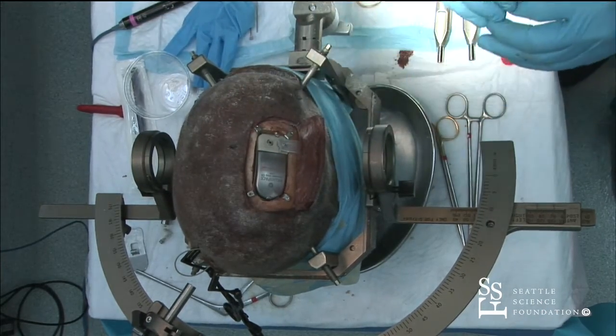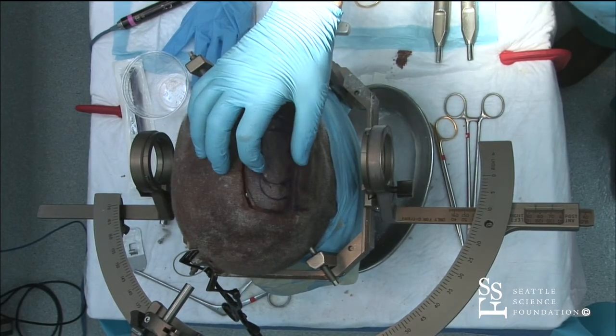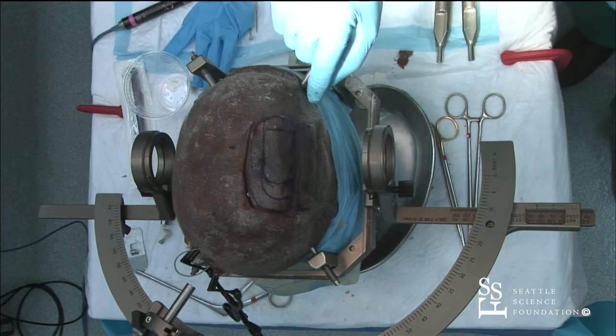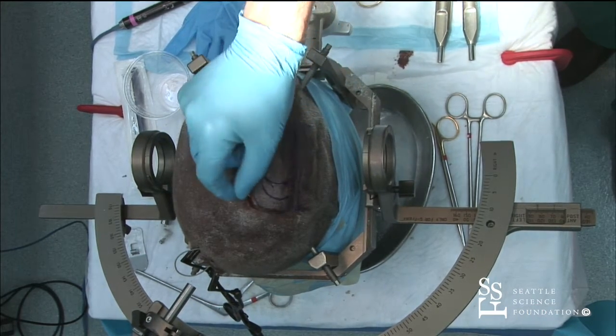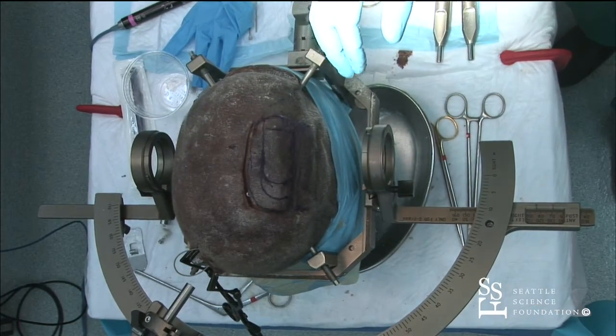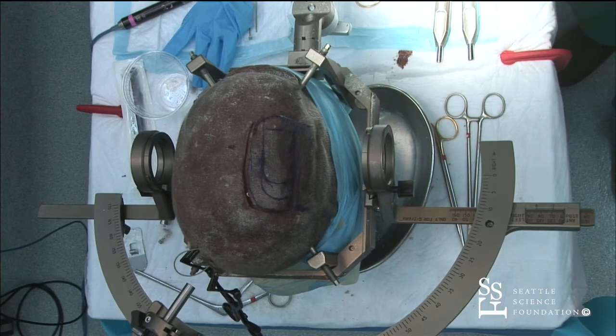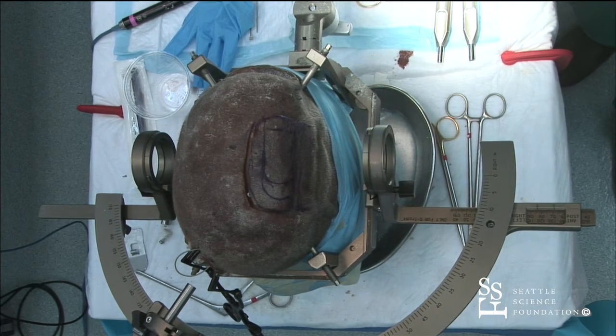So I'll use 2 Vicryls for the galeal layer, and then I use a 4-0 Monocryl, which is an absorbable suture, pretty thin, and I do tiny little stitches all the way through the dermis, and then I put glue on top. So there's nothing to take out afterwards. You get a very good watertight 2-layer closure that way, and it's pretty darn cosmetic as well.